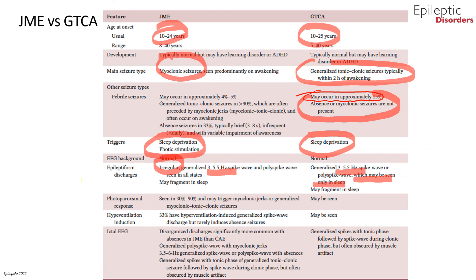The ictal EEG between the two syndromes also differs. In JME, you can see generalized poly spike-wave with myoclonic jerks and 3.5 to 6 Hz generalized spike and wave or poly spike-wave with absence. The ictal EEG for generalized tonic-clonic seizures alone shows generalized spikes during the tonic phase followed by spike and waves during the clonic phase.